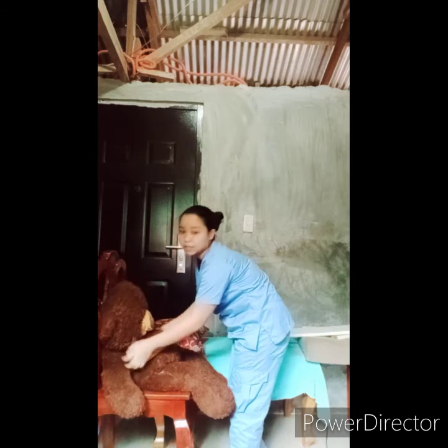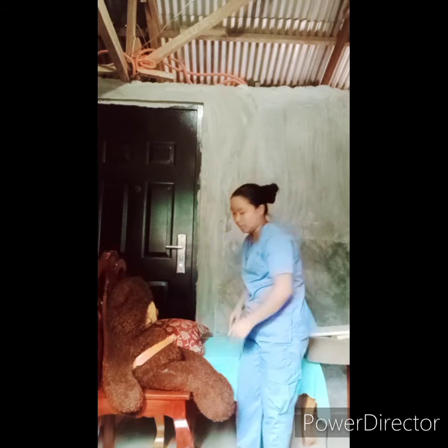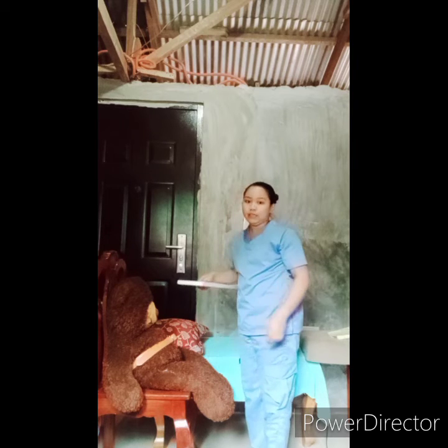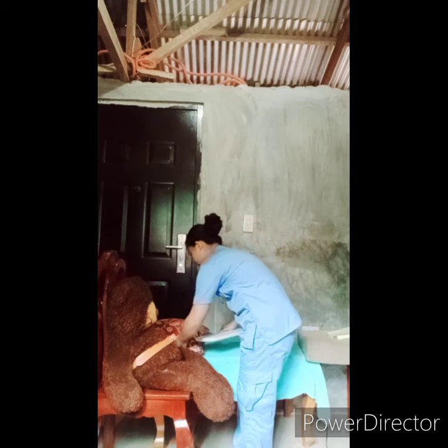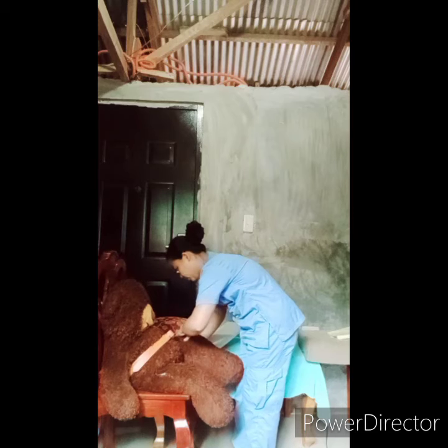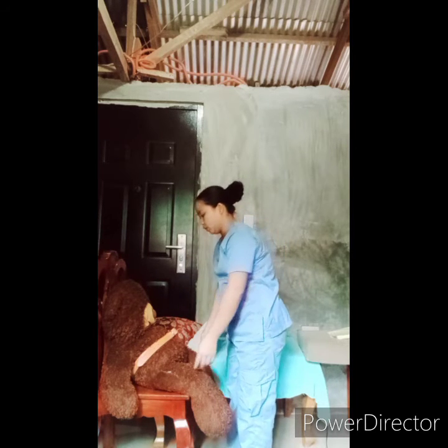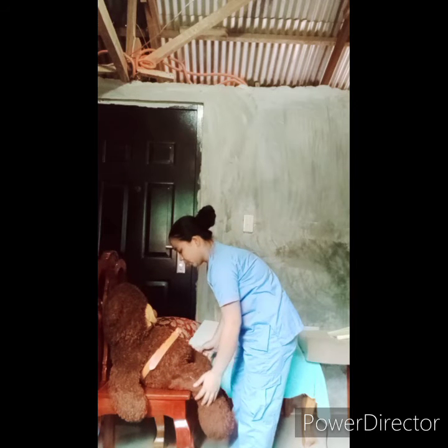After placing the transfer belt, let's position the seat of the chair level to the bed if possible. And next, let's position the transfer board so the patient can slide. Position the transfer board and let's ensure that the board will not slip out of place. And then next, let's stand in front of the patient and have the patient move to the front of the wheelchair.